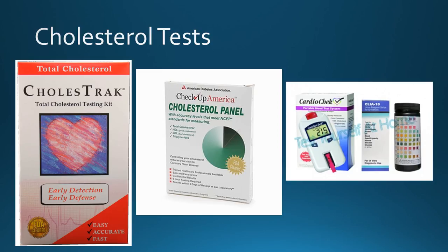The center one here, Checkup America, it can actually provide a full cholesterol panel including LDL, which is then sent away to a CLIA waived laboratory. So patients have to be aware that this one they do have to mail away, and it is going to take some time. And then the last one on the right is a CardioCheck, and this is pretty similar to a blood glucose monitor where it automatically provides the reading for patients. They also can test ketones and blood glucose. However, it requires a different strip and a different testing chip to code the machine, so it can get quite expensive. There's been variable reports about the accuracy of these tests.